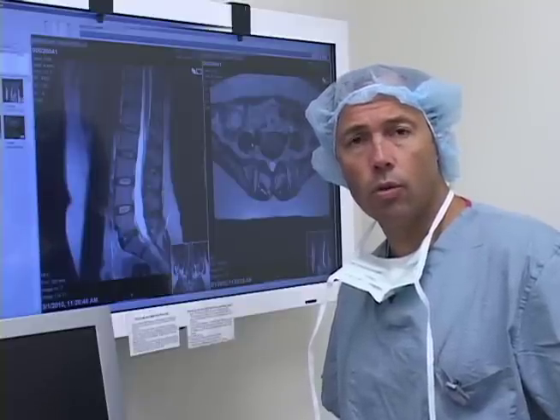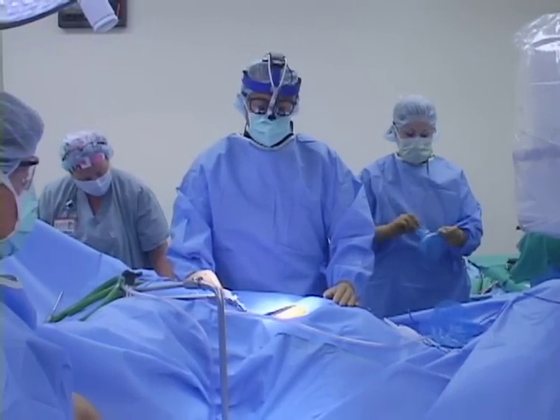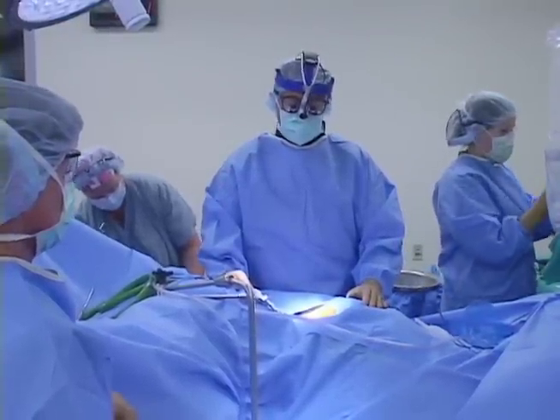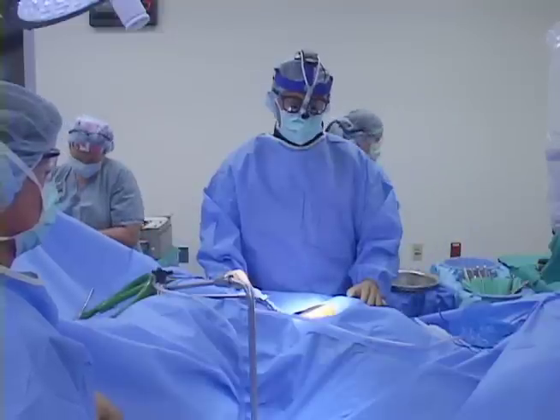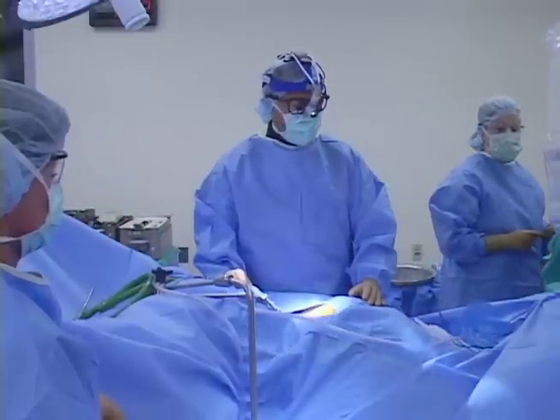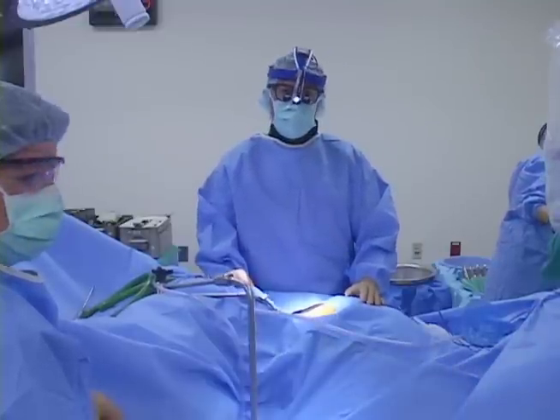This is what we found in this individual's case. Today we're going to proceed with the minimally invasive TLIF, or MIS-TLIF for short. This is a typical setup: the patient is positioned on their belly, we have fluoroscopy in the room, and the patient is under a general endotracheal anesthetic, which allows me access to fluoroscopy and appropriate visualization of all the tools I need.